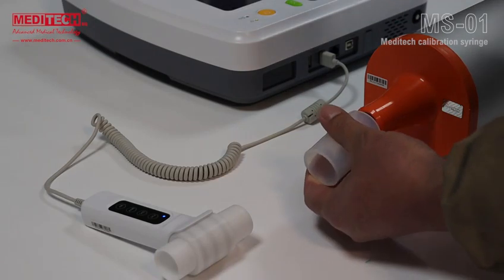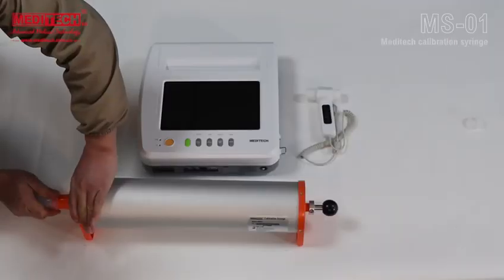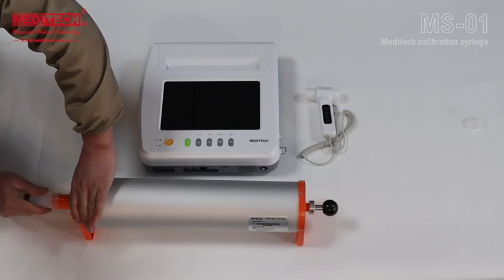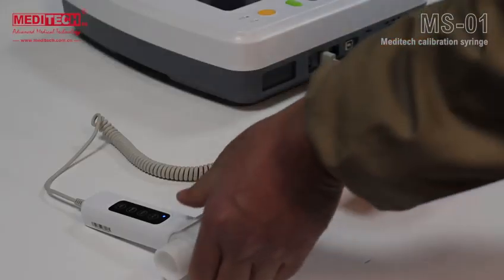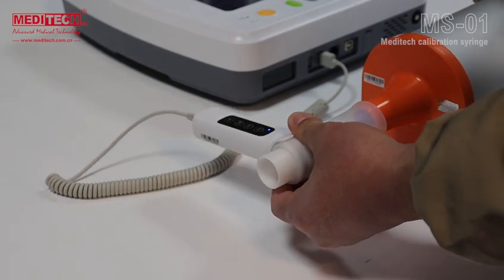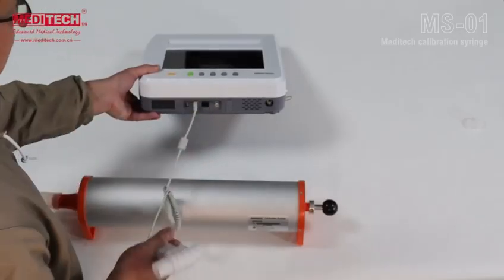The second part is to start the calibration of the spirometer. Connect the flow gun of the spirometer to the device and the calibration syringe. Use the silicone connector provided and connect the other side to the calibration syringe with a little more force. Check that there are no gaps or air leaks, then connect the flow gun cable to the USB interface.